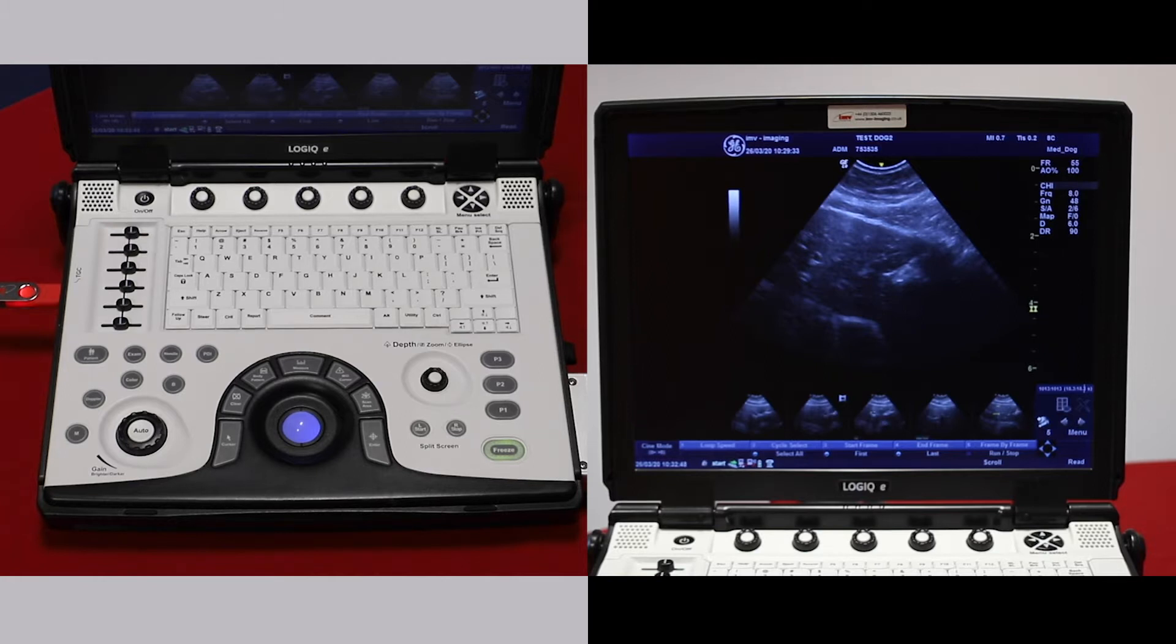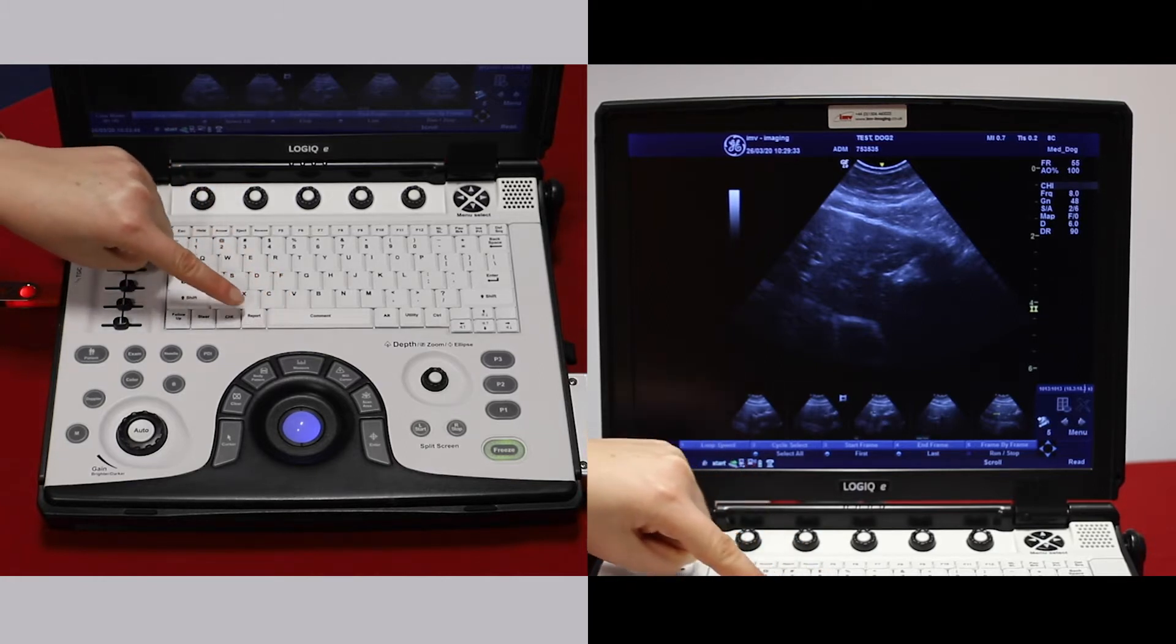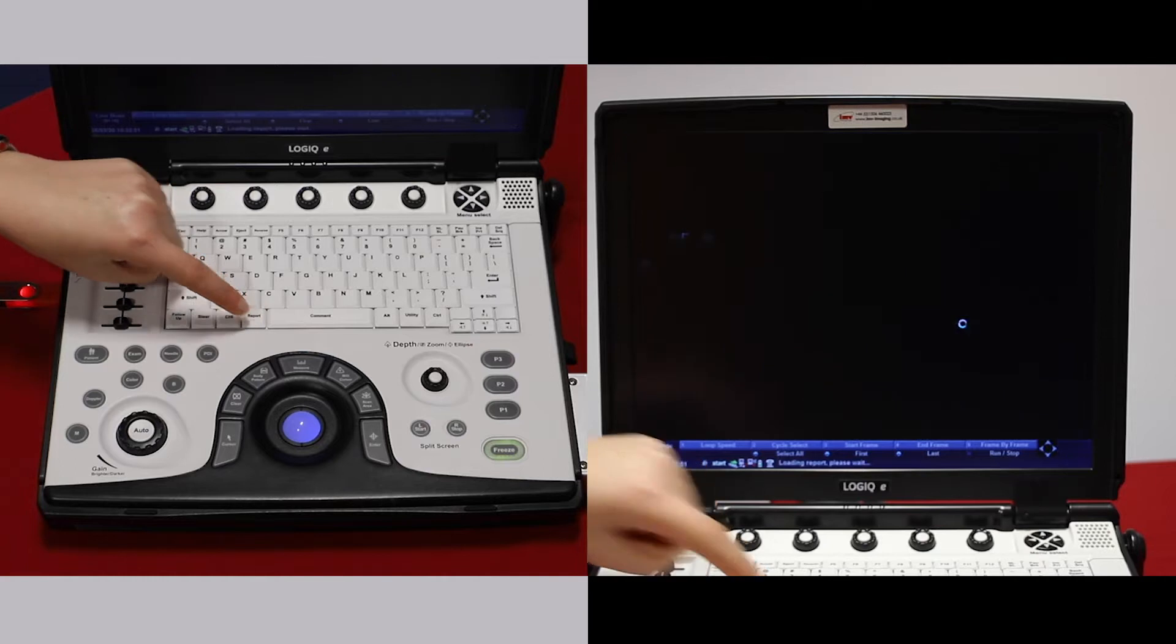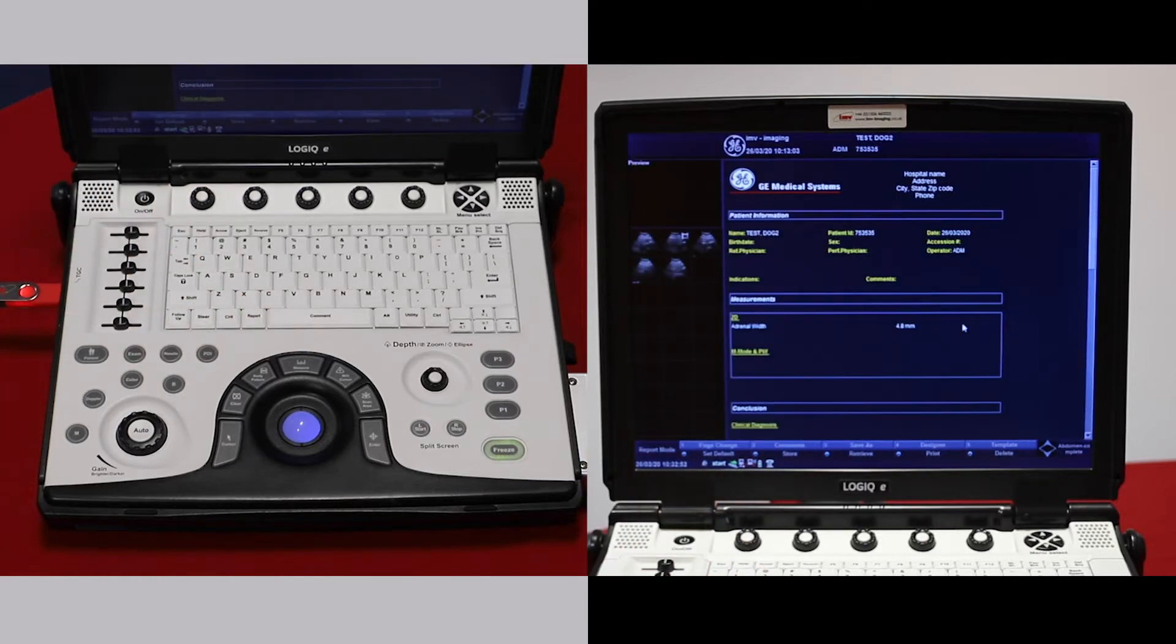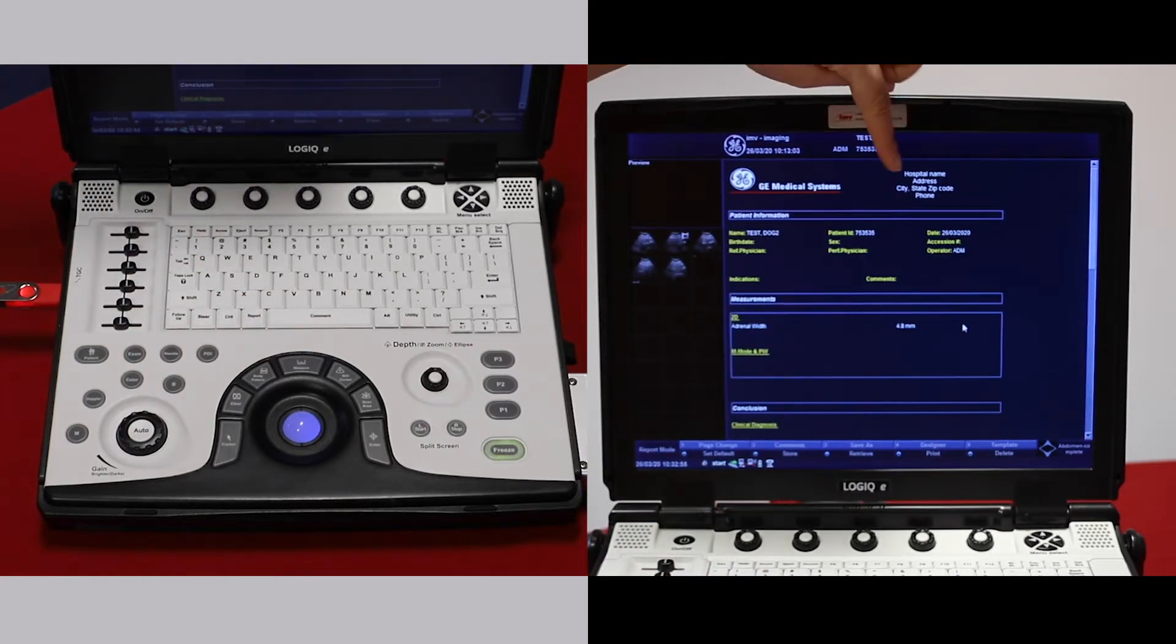If you'd like to make a report for your patient, the report function is just to the left of the space bar. We can set these up for you so that you have your own hospital name.